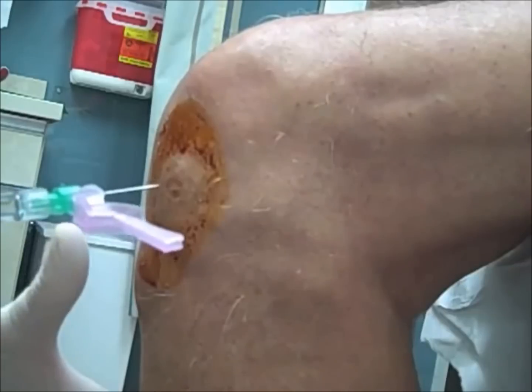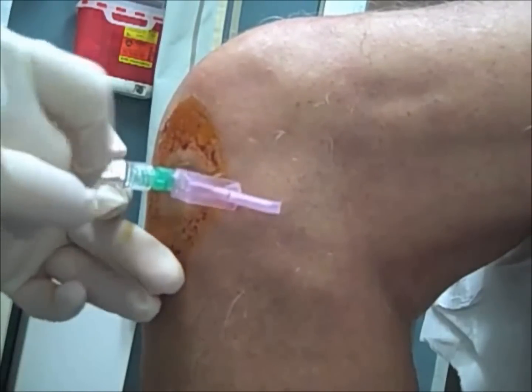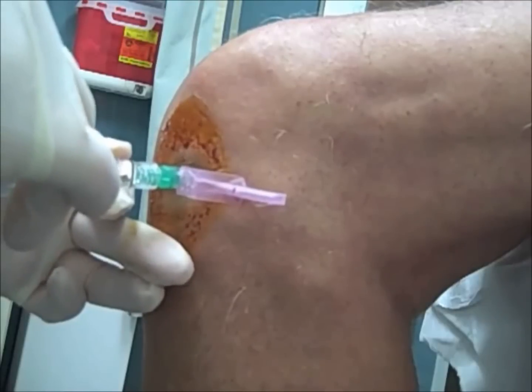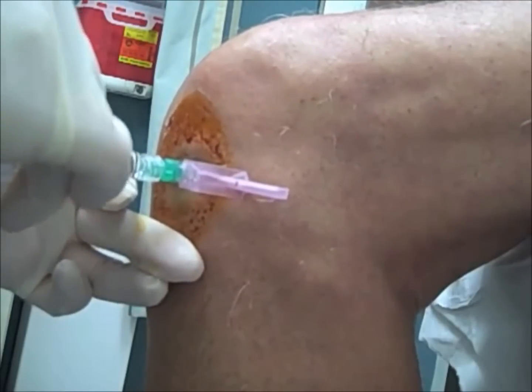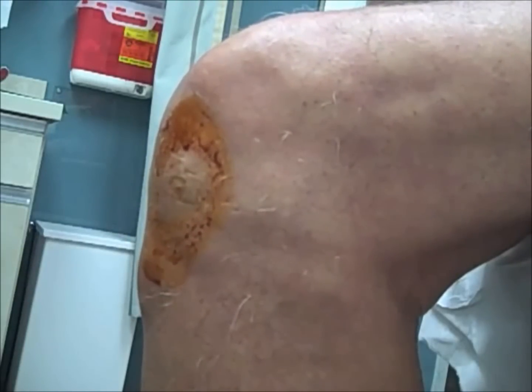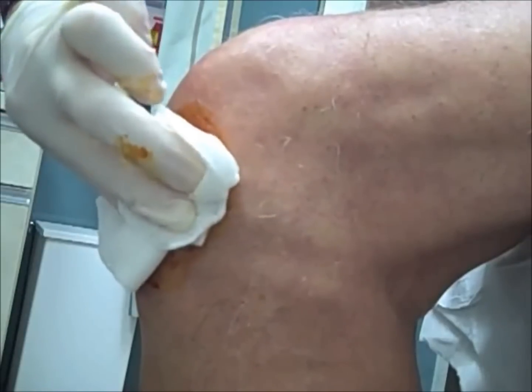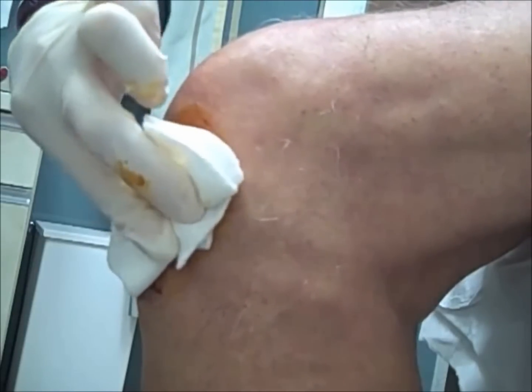So again, with the injection site marked, we keep the needle perpendicular to that and advance the needle and inject the medication. If you encounter resistance with advancement of the needle or injection of the medication, we just reposition slightly until the needle or medication moves smoothly.